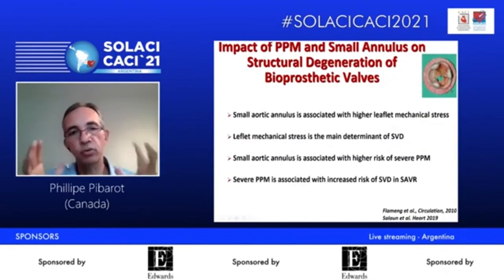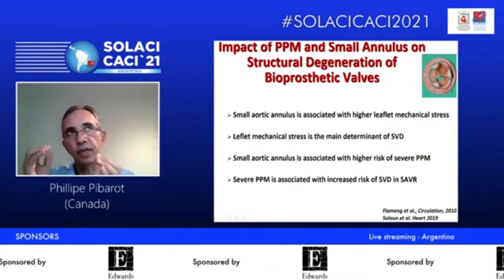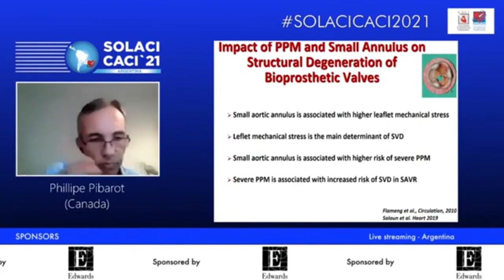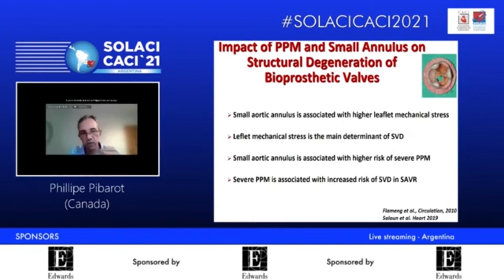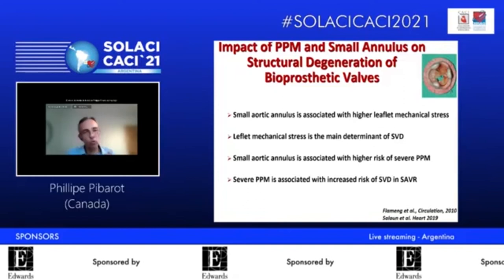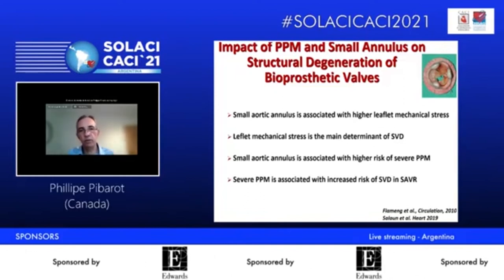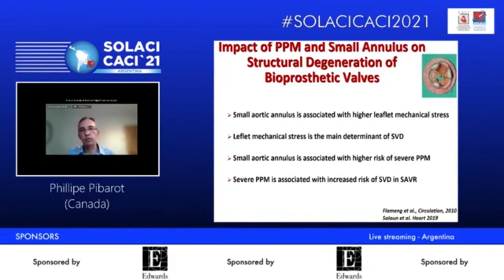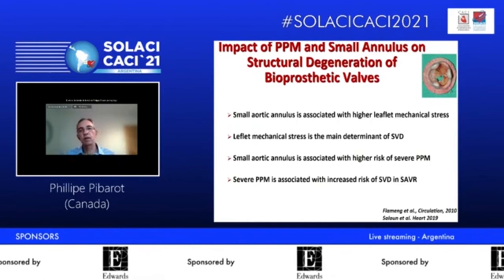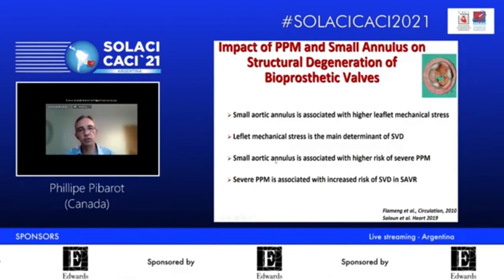Now, and this is one of my last slides, it is very important to keep in mind that we have to look more into the future. Of course, we are always very interested in the short-term impact of hemodynamics and mismatch on 1-year, 2-year mortality, but let's have a window of more than 10 years. In this regard, we have to pay attention that a small aortic annulus will be associated with higher stress, more pinwheeling, especially following TAVR.